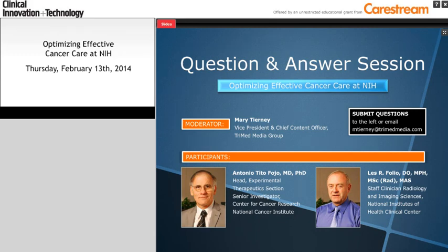As we progress in this direction, we continue to close our communication gaps with oncologists, such as this seminar with both oncology and radiologist perspectives, and we start to get more detailed histories, where we know this is the type of cancer, the baseline study we're comparing with was this particular date, or say the best response or the nadir, to know what exam to compare to. Closing these communication gaps and integrating oncology nurse practitioners and super X-ray technologists in measuring the lesions makes it simpler and will save time in the long run. We haven't measured that particular part specifically, but we have measured the time savings in the lesion tracking, as you can see from some of the prior articles. But we are working on the oncologist surveys and the workflow time efficiency, if you will.